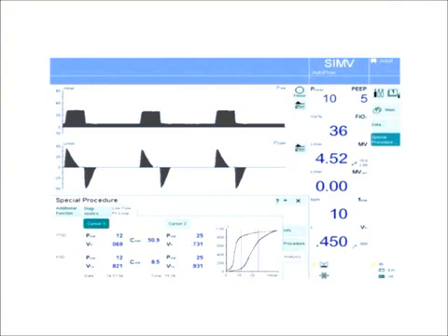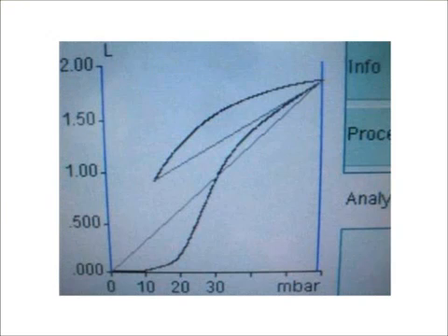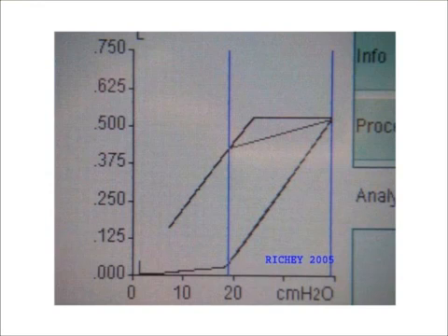So I'm just showing this example. The next tab down is after we did the procedure, is the analysis of the PV curve itself. What that does is it allows you to scroll over and evaluate portions of the PV curve itself, looking for upper and lower inflection points.